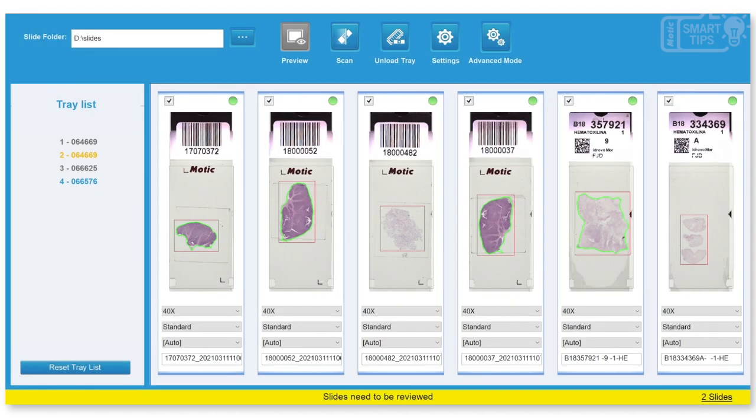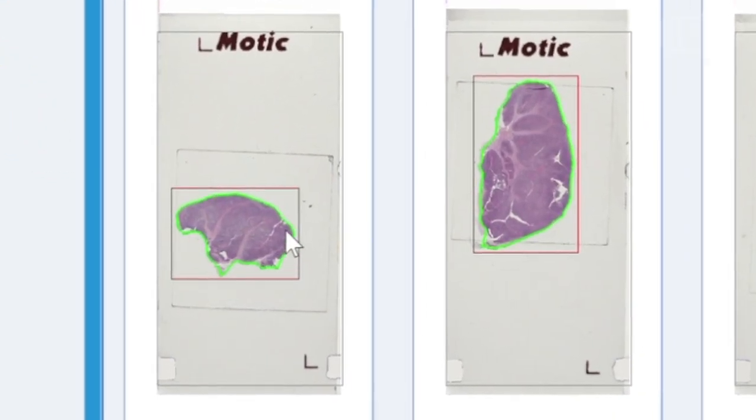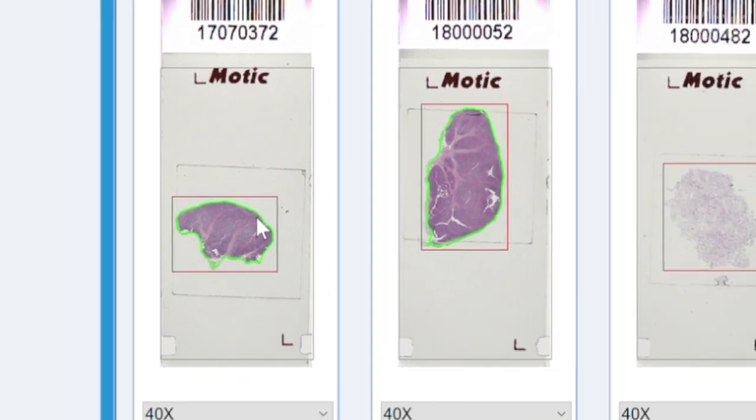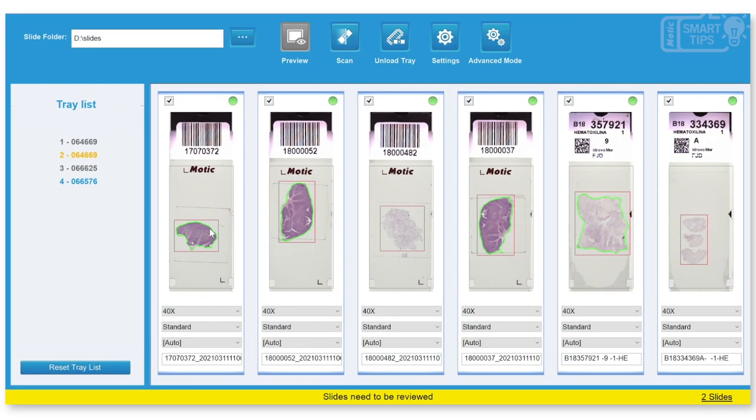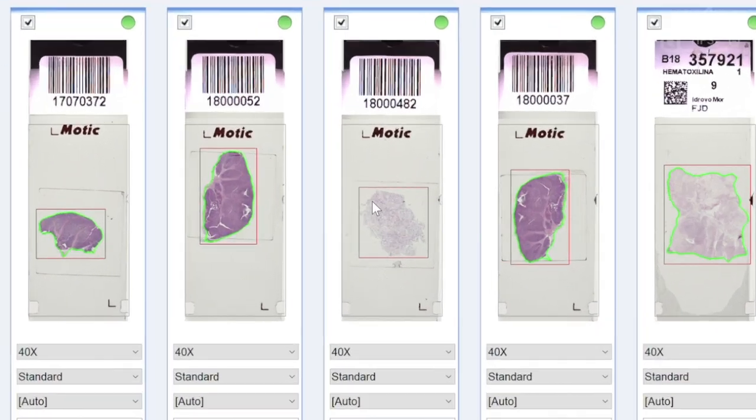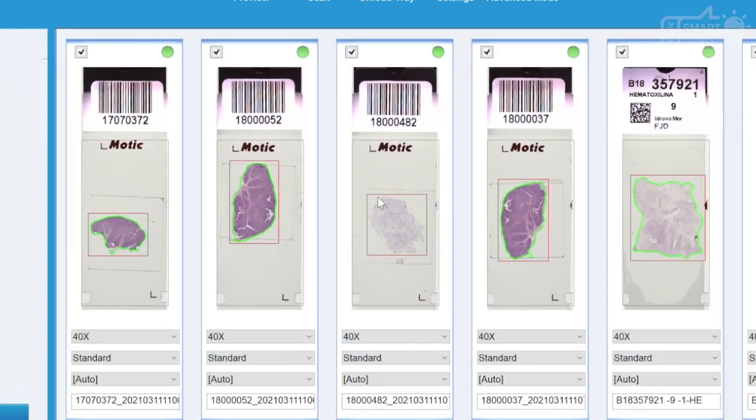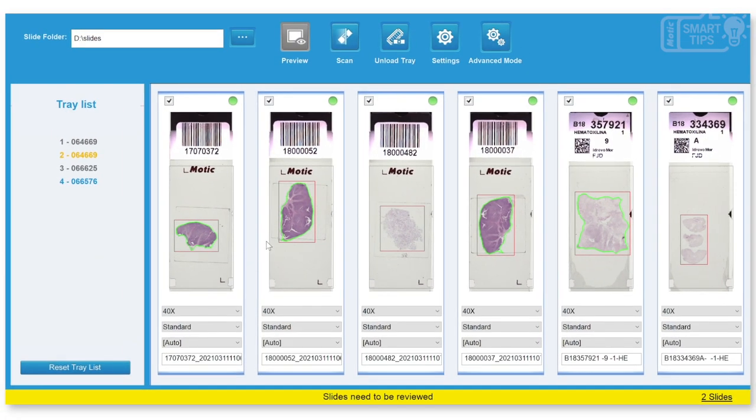Once the preview has been loaded, you can see that some slides have a green outline and some others don't. What this means is that in the slides with the green outline, the program has automatically detected an area very defined and it has decided to automatically scan only what's inside the green area. On the red ones it has detected that there's not enough definition to select an entire exact limit. So the entire red square will be selected.